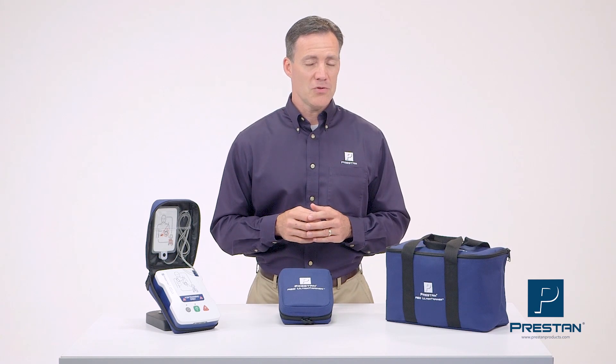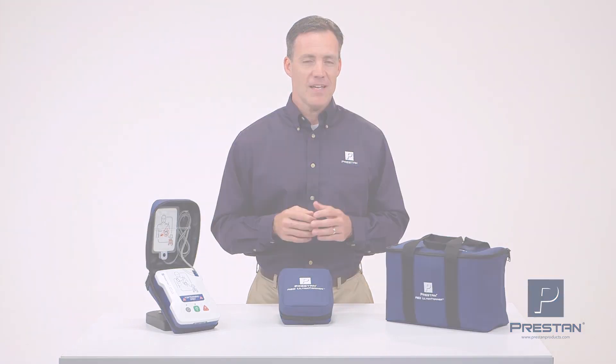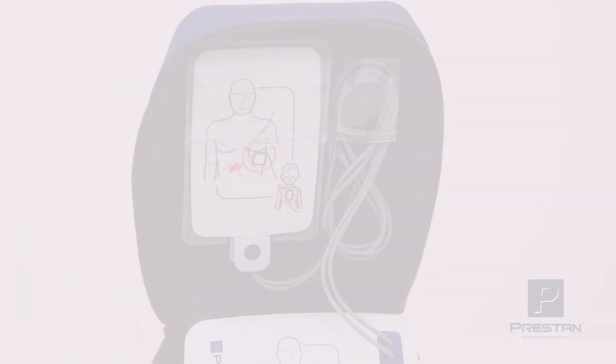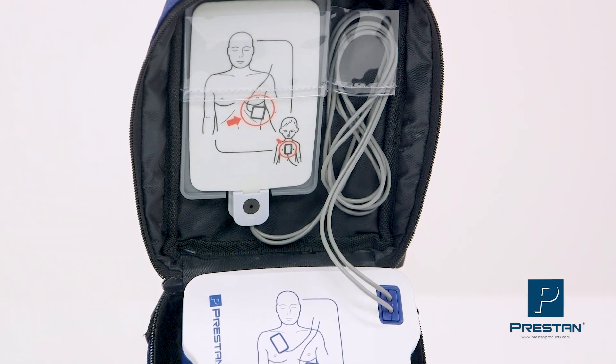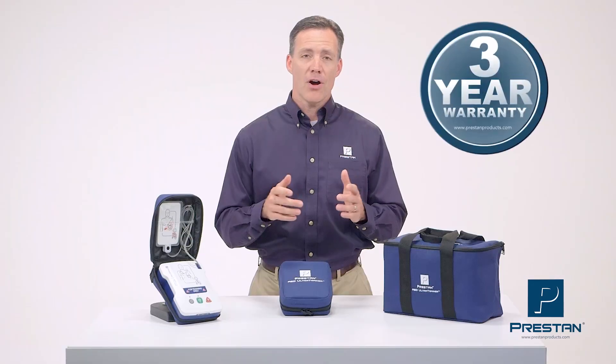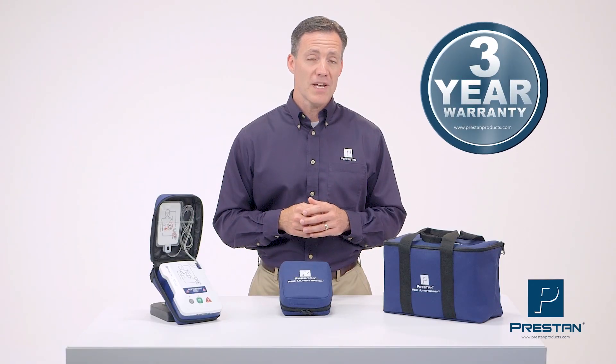Now you can upgrade to a better option. Introducing the Preston AED Ultra Trainer — a reliable, state-of-the-art, quality product that is not only affordable, but also supported by a 3-year warranty.